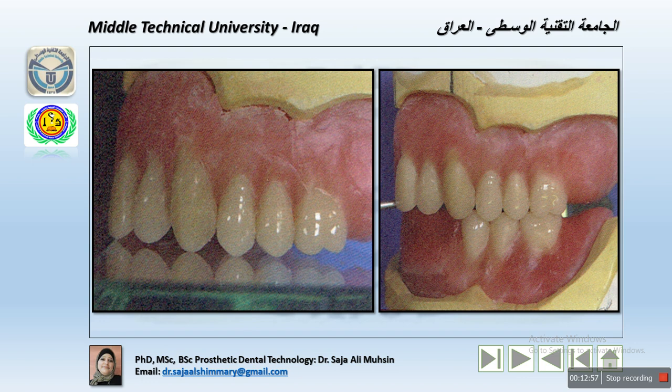Now, the second molar tooth should only be placed if there is room to do so, without placing it over the sloping part of the ridges, that means at the maxillary tuberosity or the retromolar pad in the lower, which would cause denture instability. Placing the last molar tooth would mean it was over a sloping part of the mandibular ridge, so it has been omitted.